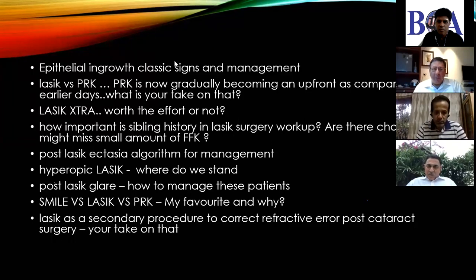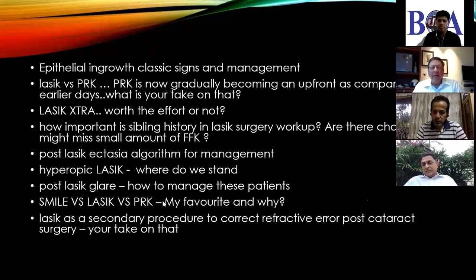Use large optical zones because regression is common, as you mentioned, Shashi. And I would 100% do a Topolink because the angle kappas here are usually quite nasty. So don't just do a standard old LASIK, because you land up in a problem.